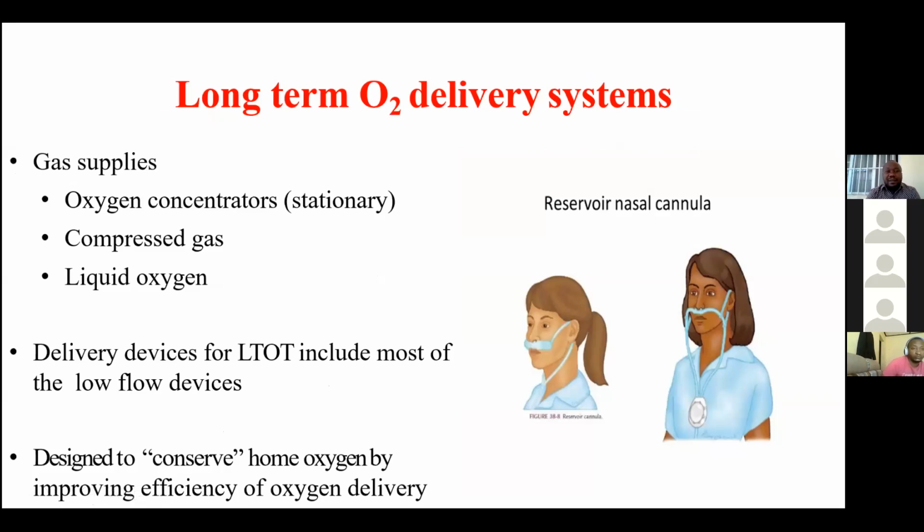There is another thing you have to think about. After COVID recovery, we may have this long-term oxygen delivery. I think to this time, we are not yet having this reservoir nasal cannula. And we want you, by knowing it is needed, to think in your supply, in your procurement plan, about what you will be needing to help our patients we are serving in our remote area where we work.